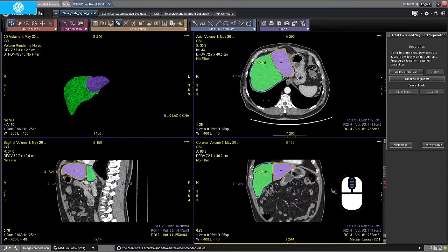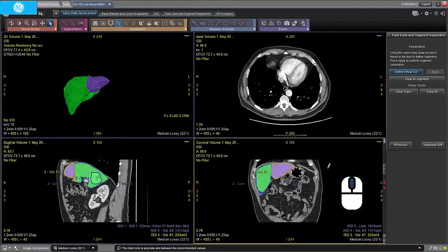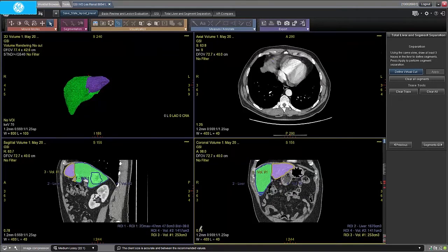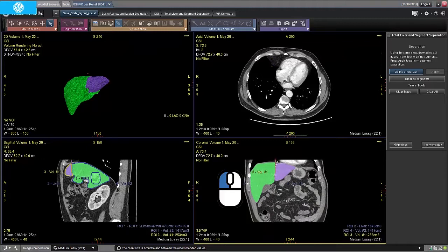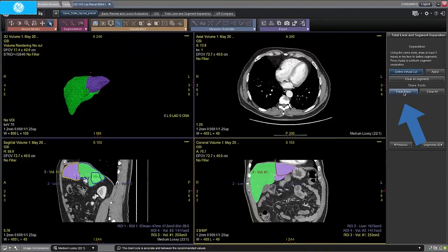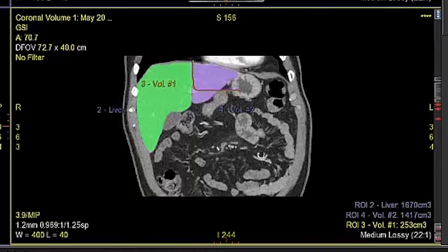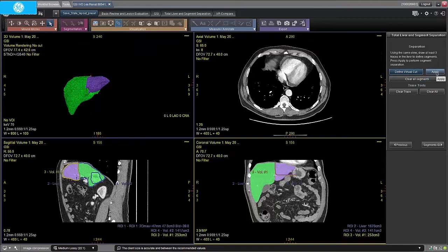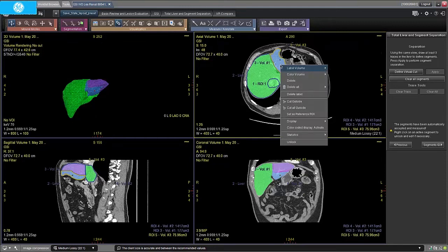We will now carry out the second separation using the coronal plane as a reference. We can apply MIP to the images to help us define the anatomy better. Remember that you can always clear a trace if you want to change it. Right-clicking over an active segment will give you access to the ROI and volume options, such as label volume and change in colour.